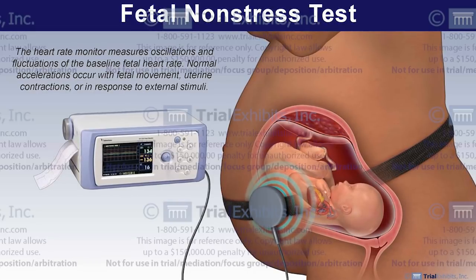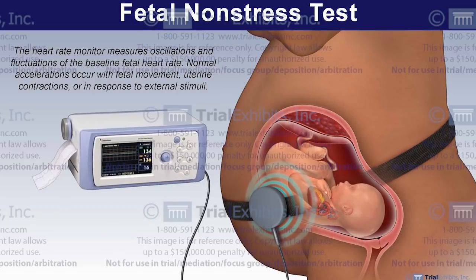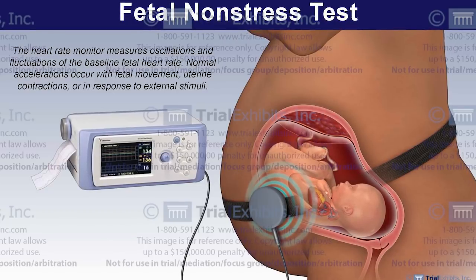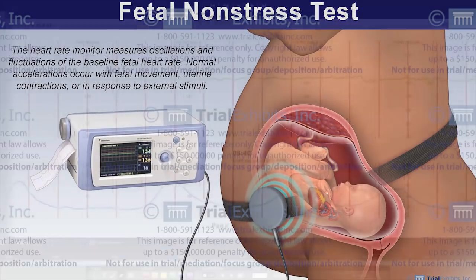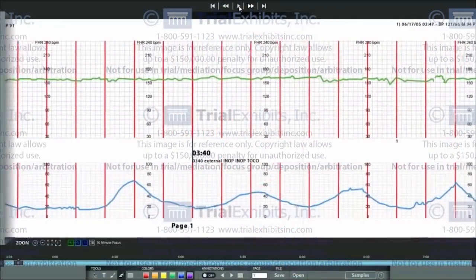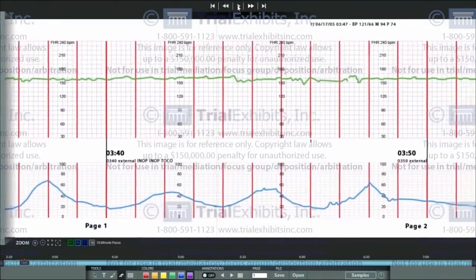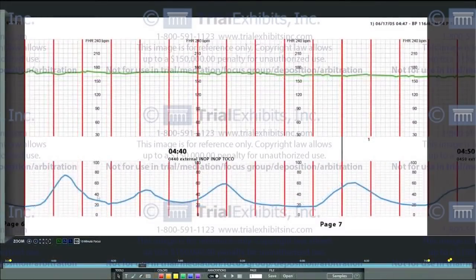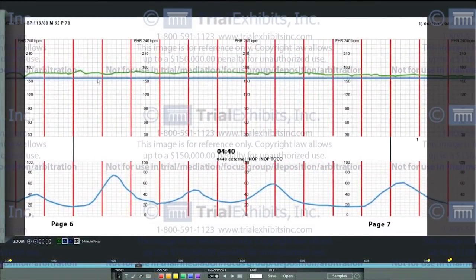Regretfully, the fetal monitoring evidence was quite voluminous in this case, and we could not simply print a few of the strips. The Trial Exhibits solution was an interactive fetal monitoring strip viewer that would allow for an electronic display of the entire collection of strip evidence.